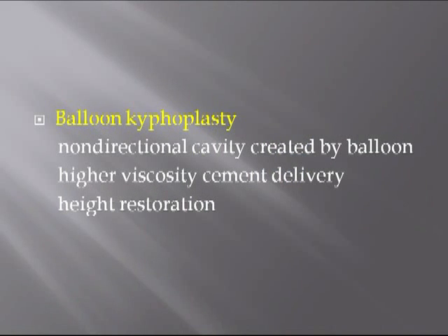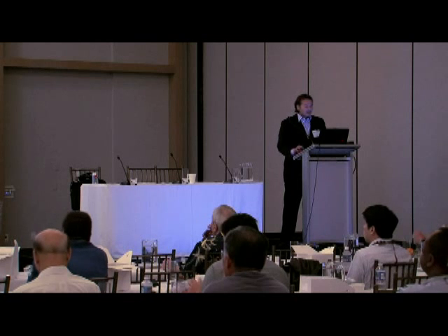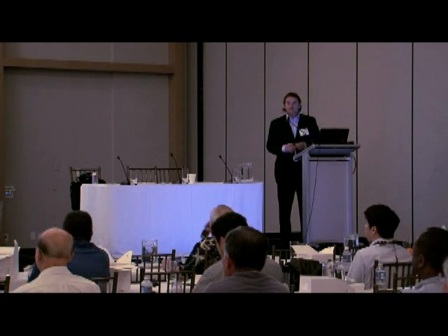Alan just talked about the traditional treatment options, the different kinds of procedures that we can do, the vertebroplasty and balloon kyphoplasty, and we can achieve good results with these procedures. Now we have newer concepts with directional cavity creation, ultra-high viscosity cement, directional cement delivery devices, intravertebral implants without cement, and non-PMMA cement. Of course, there is no ideal product.